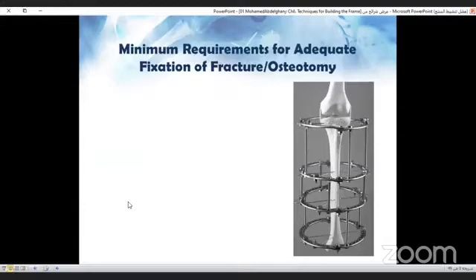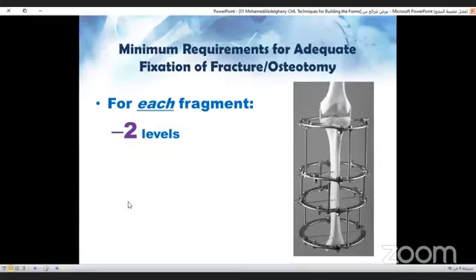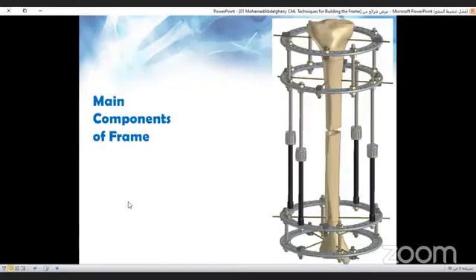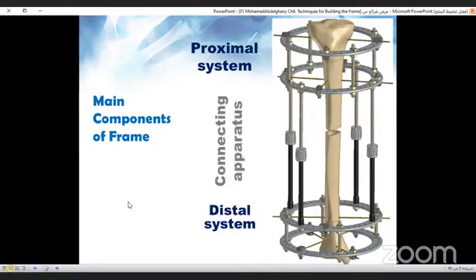Adequate fixation of a fracture or an osteotomy requires at least two levels and two different directions. The main components of the frame are the proximal system, the distal system, and the connections in between.